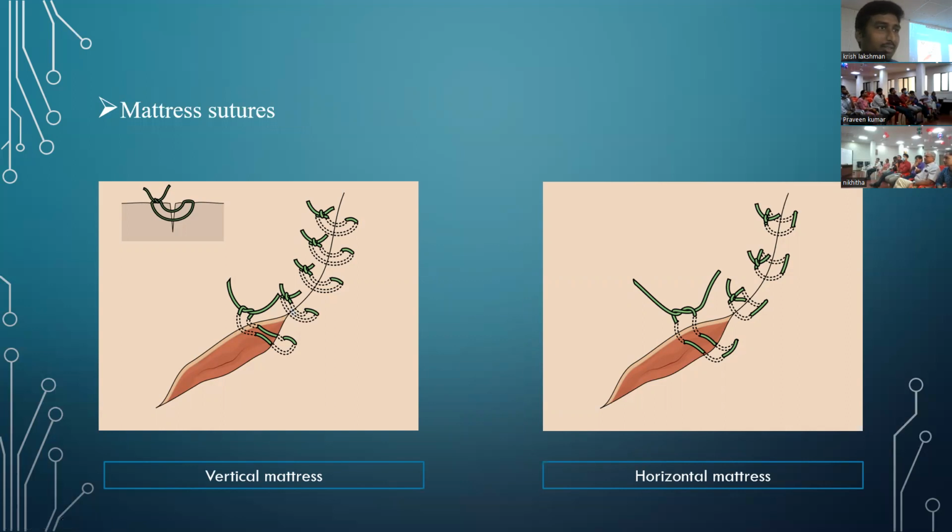In abdominal wall closures, skin closure. Wherever you want something, I mentioned it, it's more strength. Then you have to ensure something about the edges, the way the edges get approximated. You will always ensure eversion. And second, when you want to obliterate dead space. That is when you are going to use a mattress as against a simple stitch.